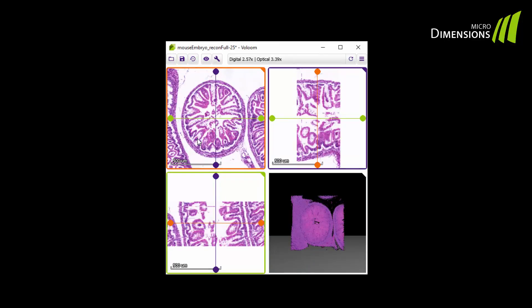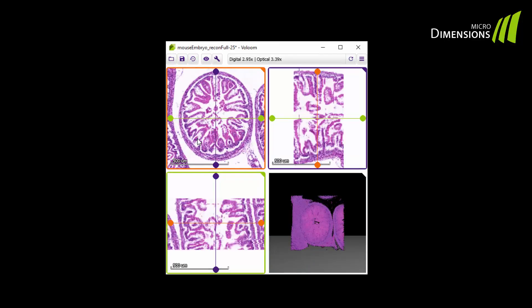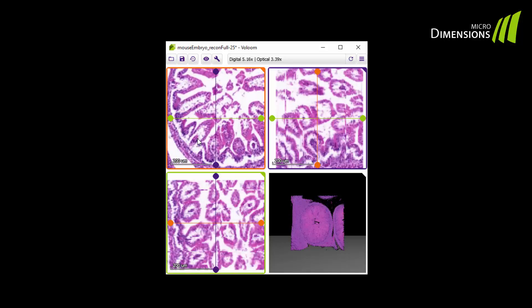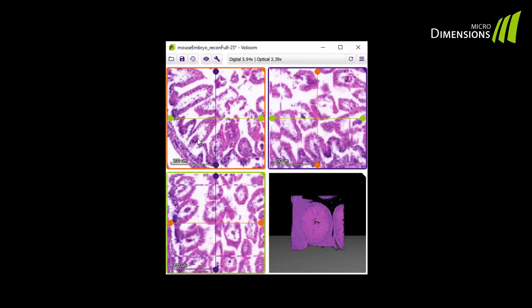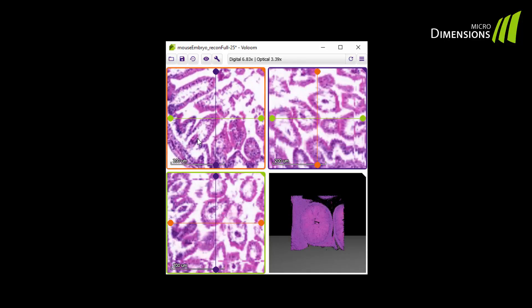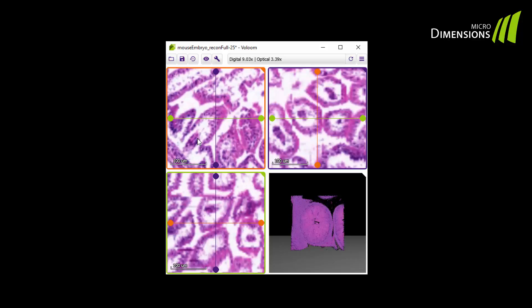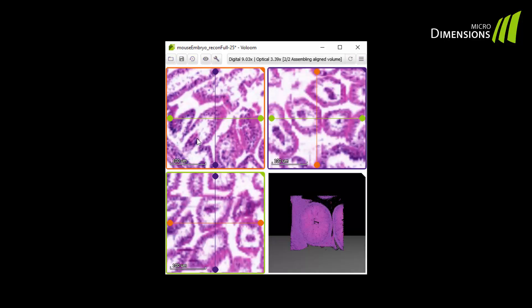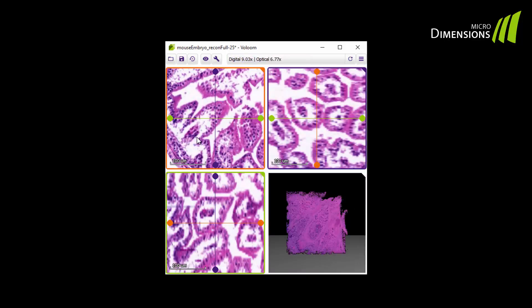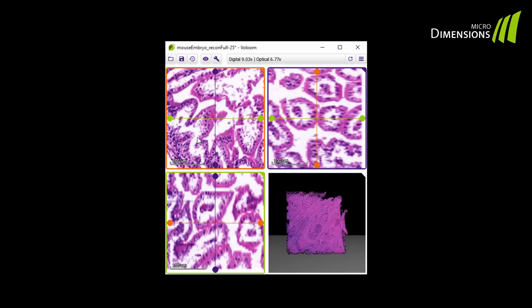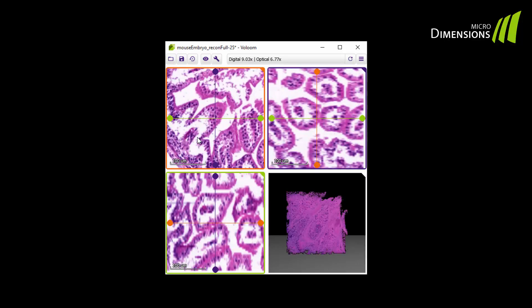You can zoom into the image by using your mouse wheel and holding the control key at the same time. The magnification level is shown in the lower left corner of the views. Press F5 to reload the images at the selected resolution. This reload also optimizes the regional slide alignment.